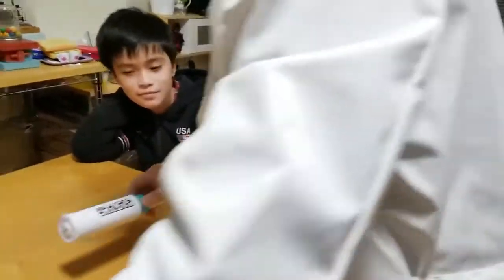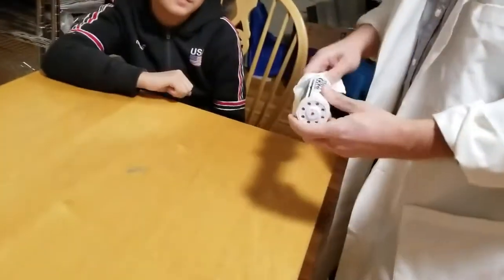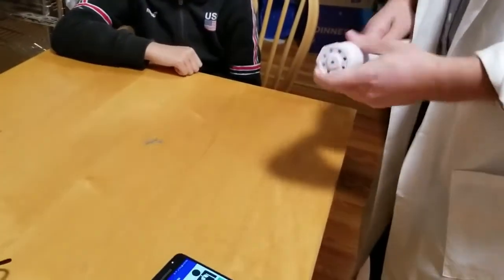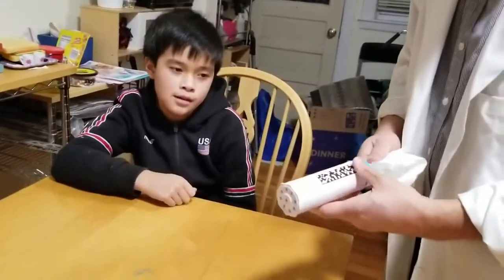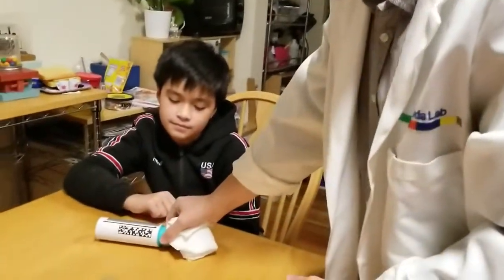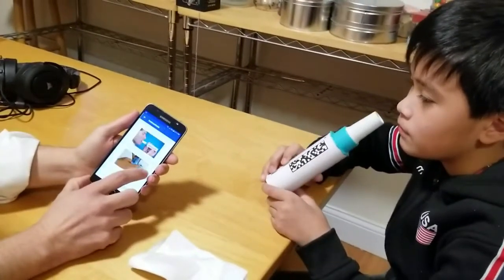This is a peak flow meter. So I want you to blow into this when I tell you, okay? And you don't have to breathe into it, you just blow. Blow as hard as you can, okay? So I'm going to give that to you. So we're going to start the peak flow meter test here.